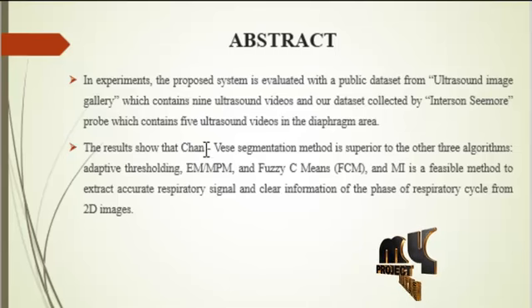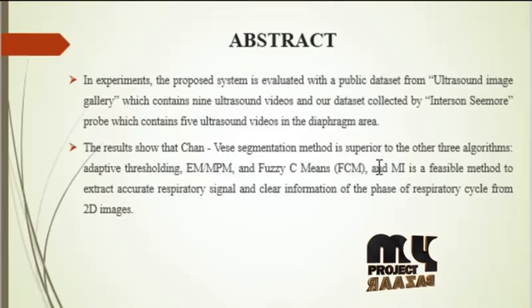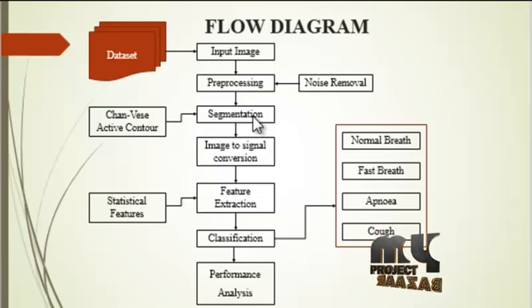The results show that the Chan-Vese segmentation method is superior to 3 other algorithms: adaptive thresholding, EM and fuzzy C-means clustering. MI is a feasible method for extracting the accurate respiratory signal and clear information of the phase of respiratory cycles from 2D images. Now we are going to discuss the flow of our project.